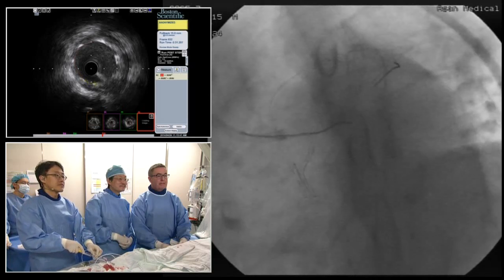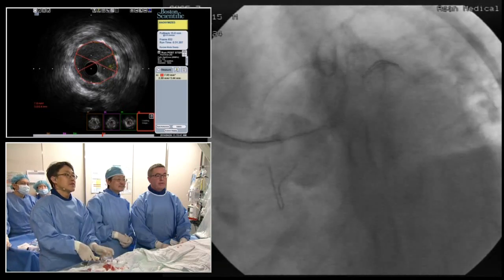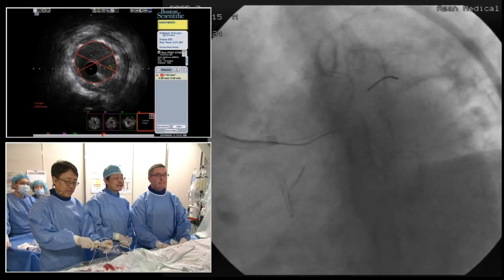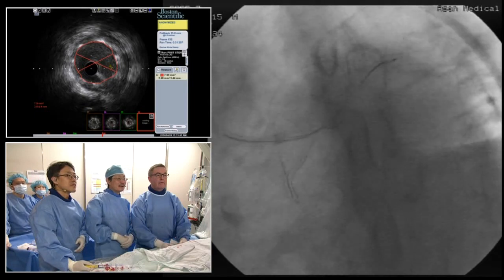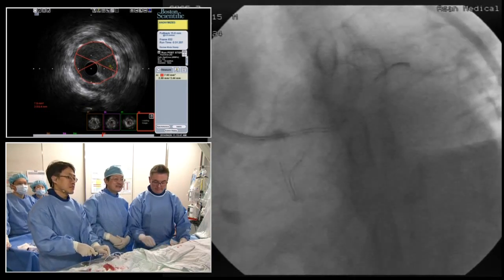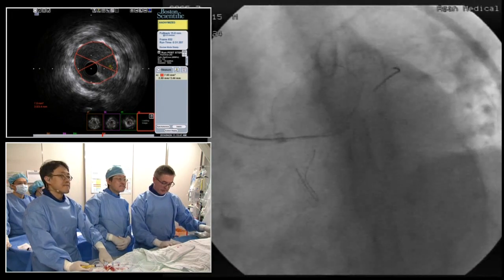So if you give me a little test shot there, just a tiny test, there you go, there he is. Maurice knows the Japanese colleagues use the double lumen microcatheter to assist side branch wiring, preventing the wire coming out of the stent.